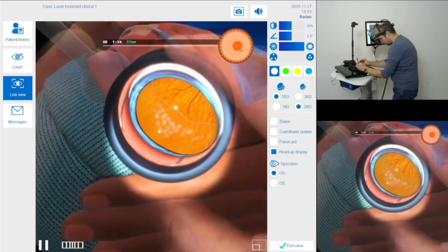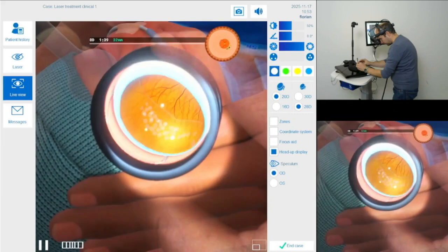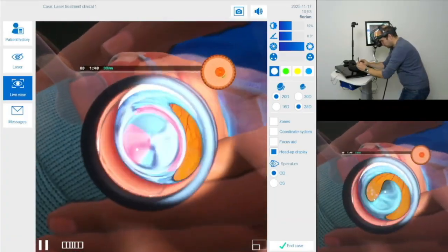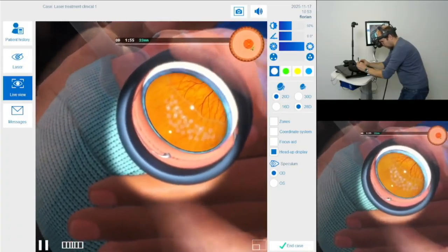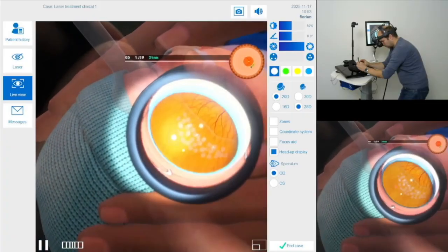If you think I did not see where I put my spots here, I think I had on the other eye a better visualization. Because here on the touch screen we see of course the view of one of my eyes, whereas I have my 2 eyes. And even if I have the reflection of the iris in one eye, I might still have good view in the other eye.